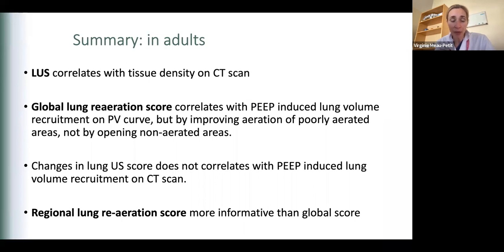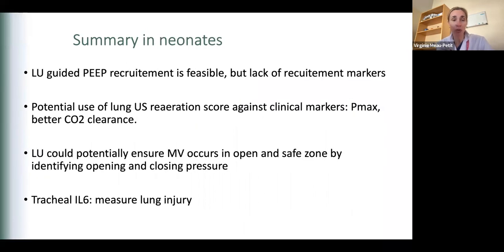And actually, what is probably more interesting is to look at the regional lung aeration score. In neonates, we know that lung ultrasound-guided PEEP recruitment is feasible, but we lack a gold standard and lack recruitment markers.